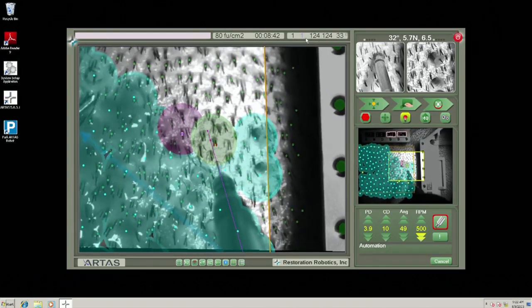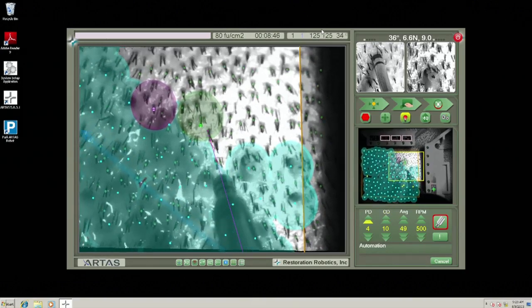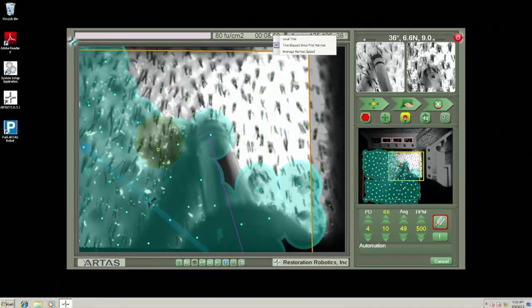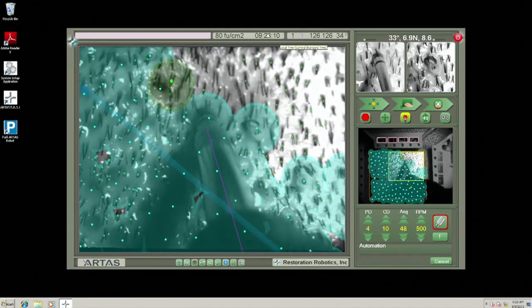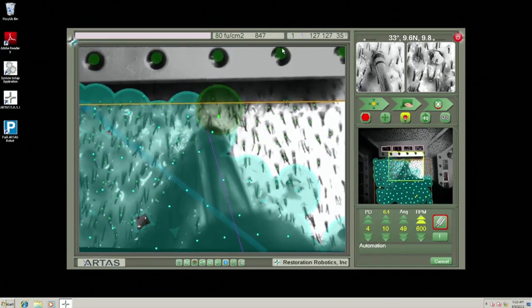The counter of how many harvest attempts is right here. So 120 harvest attempts thus far. It's been about 8 minutes. We can right click on that elapsed time. It'll tell you what my local time is here. It's 9:23 in Central Standard Time, but it also tells you what's our average harvest speed.